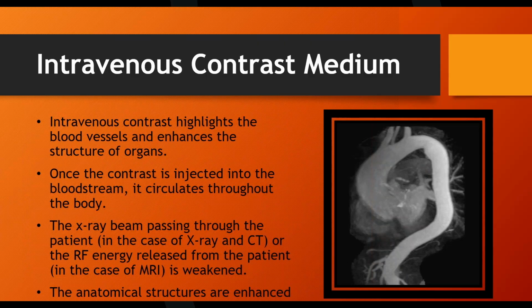I don't know exactly what it is about iodine that makes it block X-rays, but it blocks X-rays like a champ. All right. So the magic ingredient in contrast fluid for CT and angio injectors is iodine. Iodine molecularly or atomically just blocks X-rays. Now, since MRI injectors don't use radiation to produce the image, they don't use X-rays, an iodine-based contrast fluid does absolutely nothing.